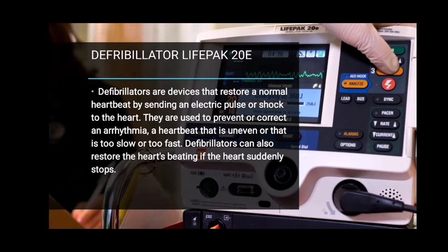Hi, I'm Emiliano Shahira Mutahiriza from the Udema A. I would like to introduce you to two medical equipment in hospital. And this is the defibrillator.